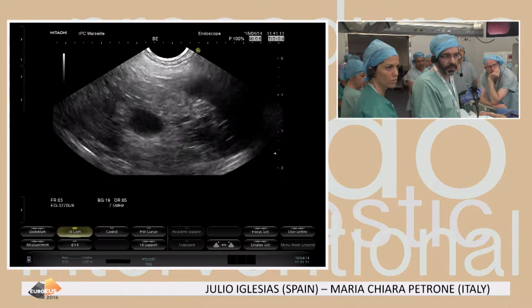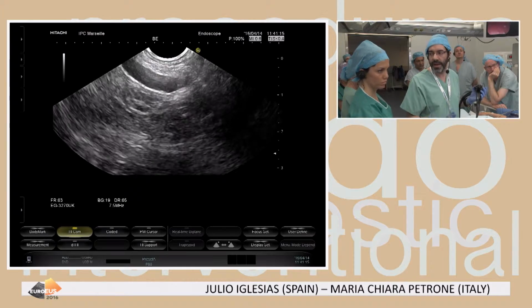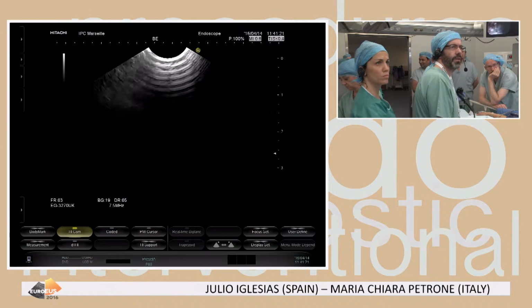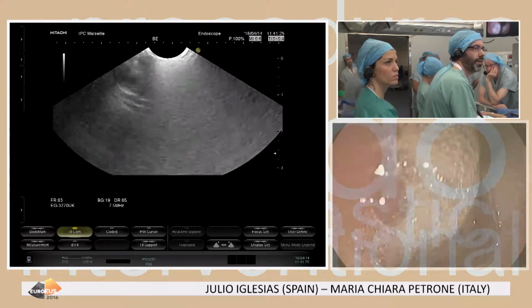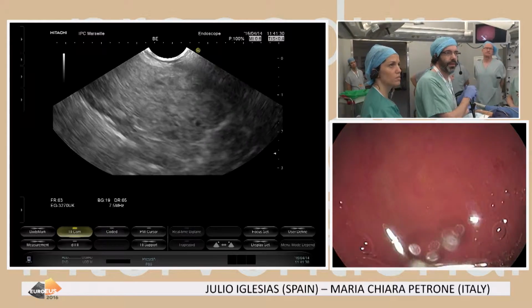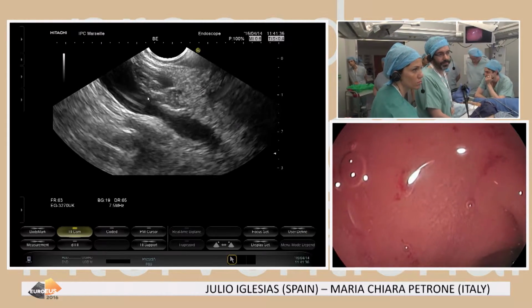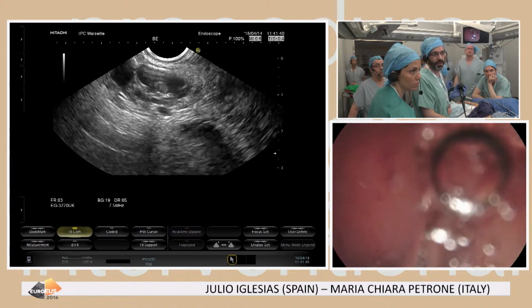So I think we're going again to the head of the pancreas, because this is a good indication to perform a Sonoview to see the behavior of the lesion after the injection of contrast. If this patient has a cyst with a nodule, and it's a large cyst, you can say that this patient needs surgery. Well, there were some features: the size of the cyst and the nodule. Mara is showing you that we have the nodule in this patient.